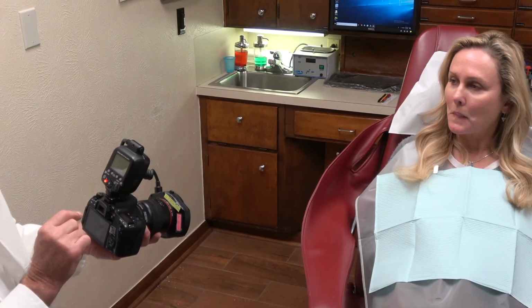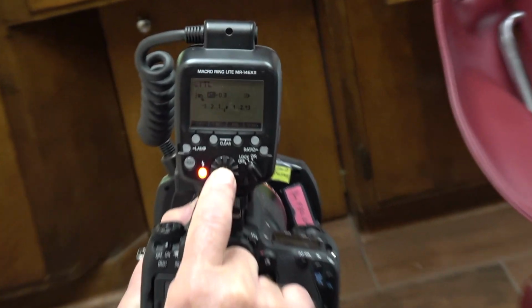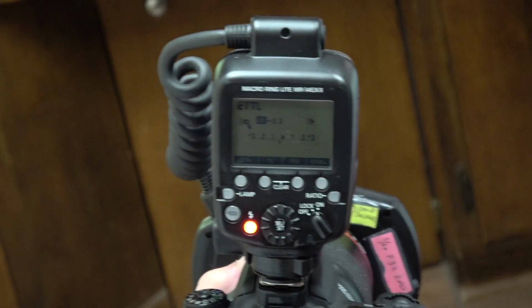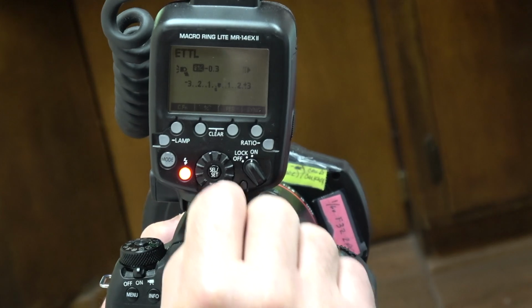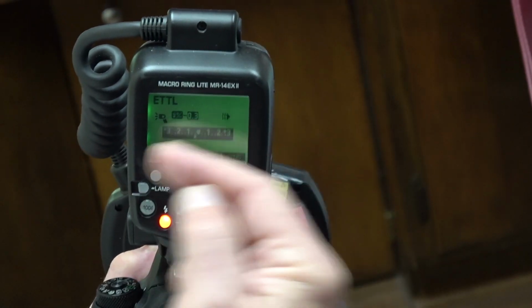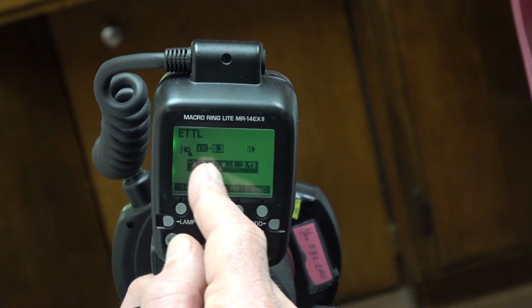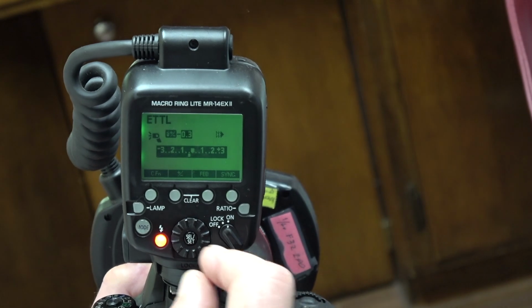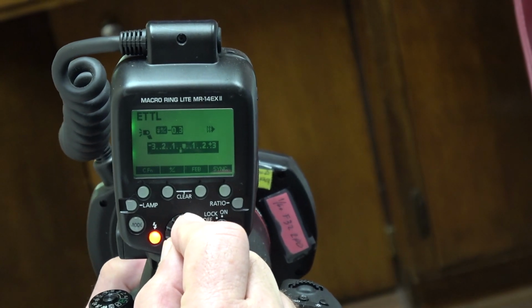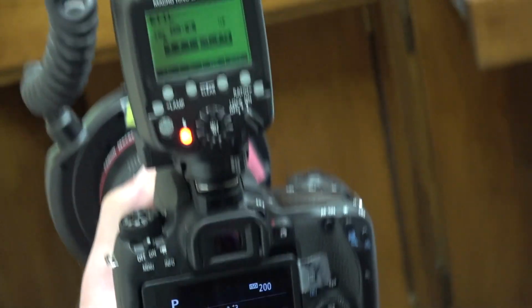Another setting that's very important is this setting right here, which is the dark or light of the flash. So you push this, and if you move the button to the left, it makes the photo darker. If you move it to the center, that's neutral.